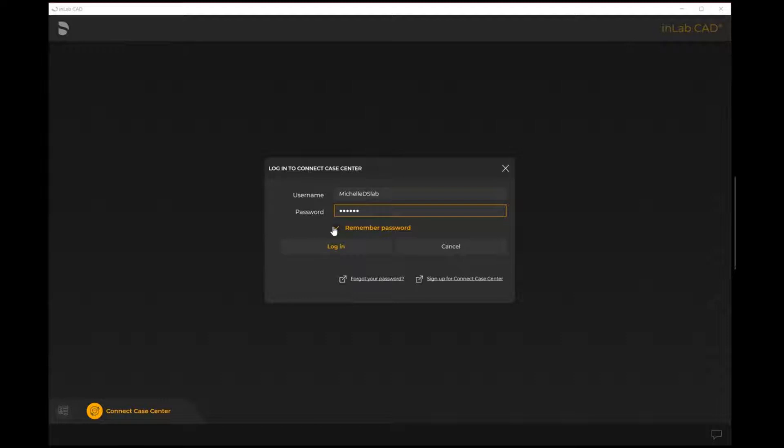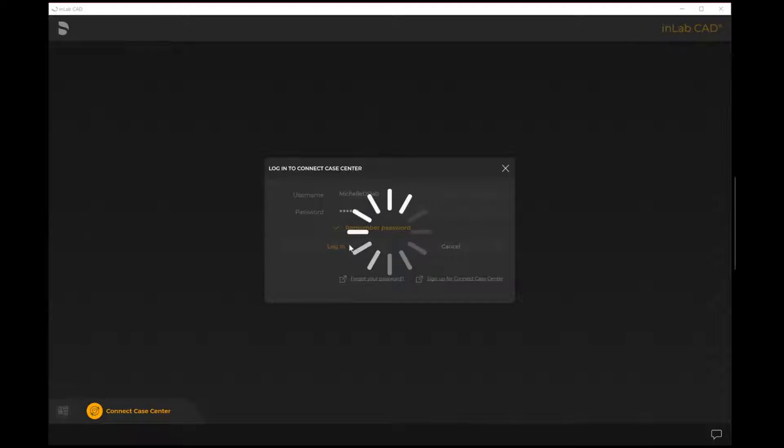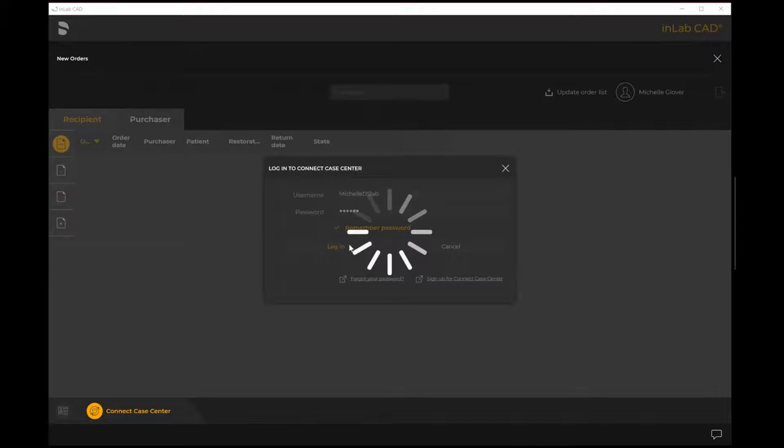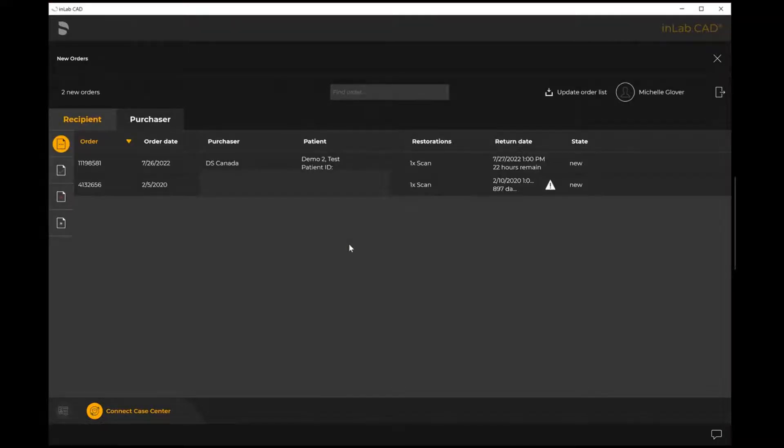If you select remember password, the next time you log in it'll automatically remember your password. I'm going to select login now and I'm going to be able to log into the portal to see all my existing files as well as any new ones.